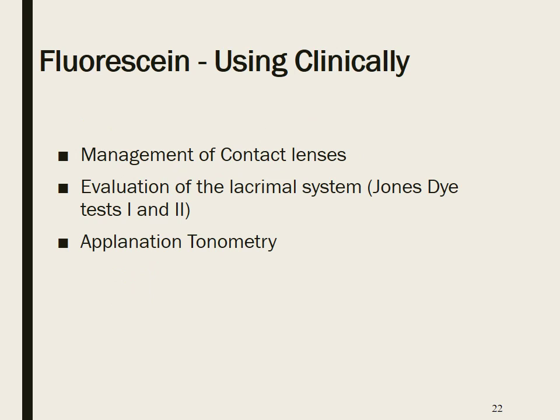We also use fluorescein for other clinical purposes, such as management of contact lenses, evaluation of the lacrimal system, where we can use it in Jones dye test 1 and 2, and also applanation tonometry, which is Goldmann tonometry.